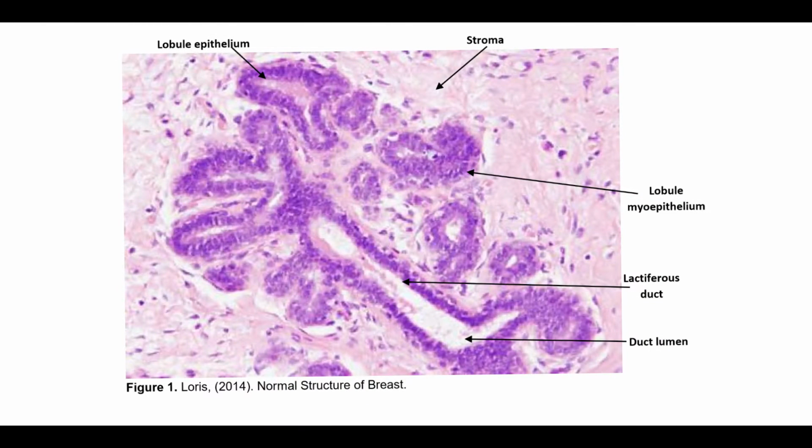This is a H&E staining of histological breast tissue. The lobules of the mammary glands are distinctive from the stromal tissue as they form circular structures plaited at some proximity to each other. These are composed of an inner luminal cuboidal epithelial layer surrounded by a myoepithelial cell layer.